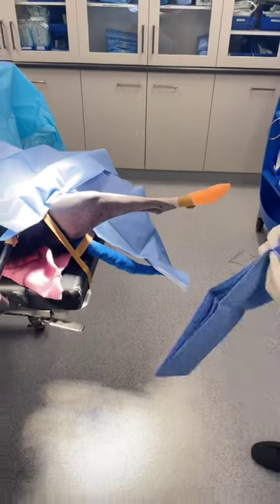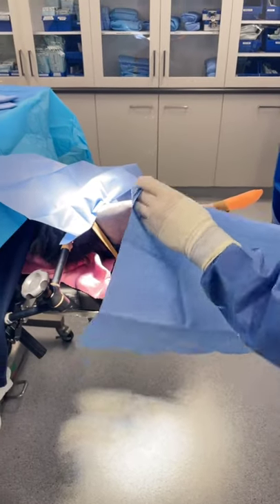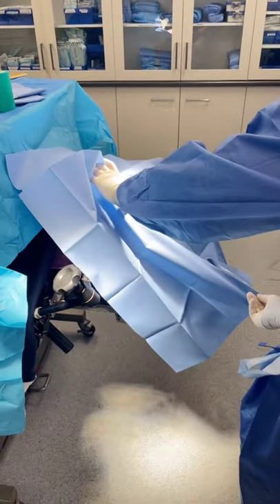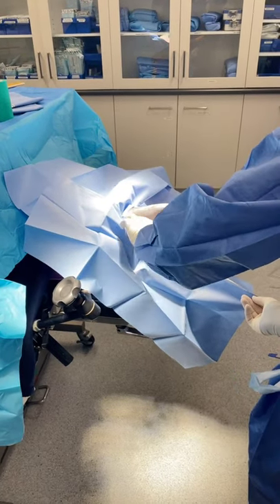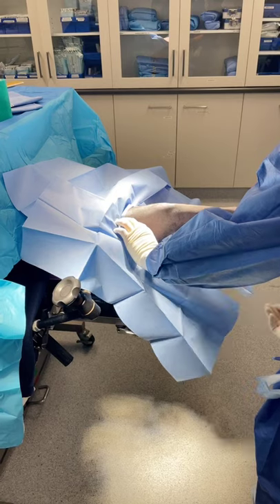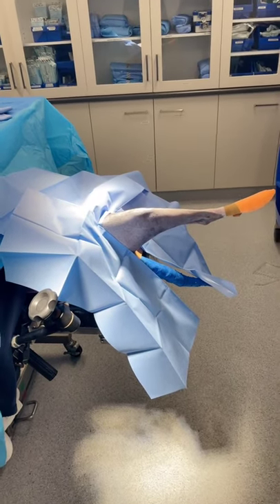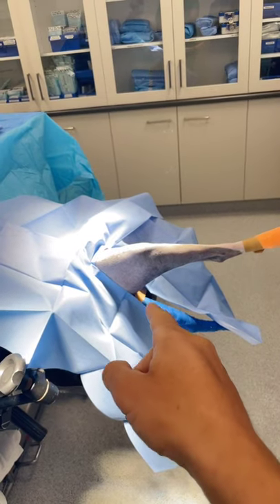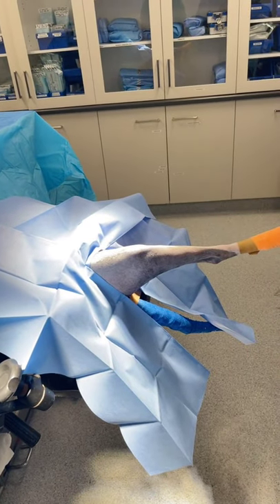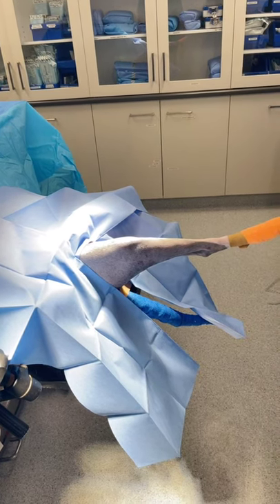Once we're into surgery, we've done that final prep and everything's dried. We apply our quarter drapes — that's what Ewan is doing at the moment. These are small adhesive drapes; there are basically four of them and they go around each side of the limb. Ewan is taking care not to contaminate himself or the drapes as we go. You'll notice we also have vet wrap over the tail — this is a border collie — just to minimise how much hair is floating around in the operating room.